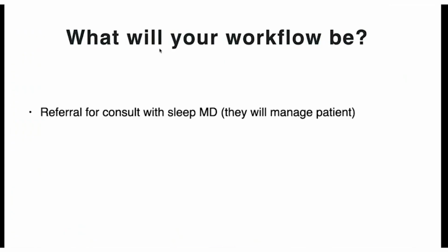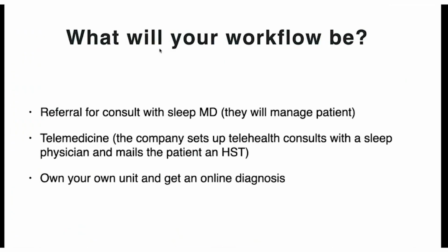So what we did is we started utilizing telemedicine and owning our own unit. And we do get a diagnosis from a sleep physician. That's a hard and fast rule. My hard and fast rules: every patient that gets an appliance has had a sleep test. We have to know what we're dealing with. There are too many other types of sleep apnea, and there are too many patients that end up being super severe that need a CPAP, and you can't tell just by looking at someone.